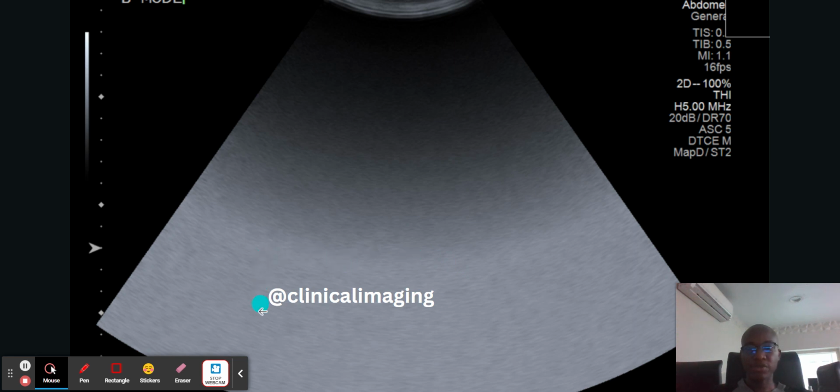Some information you see on my screen here may be different from what you see on your own system. But basically, there are a lot of features that will be similar to what I have here on the screen and what you are going to have at your own end.